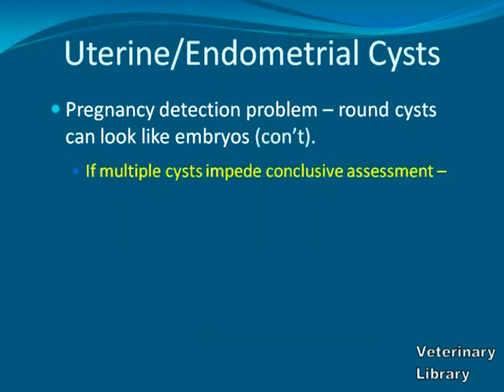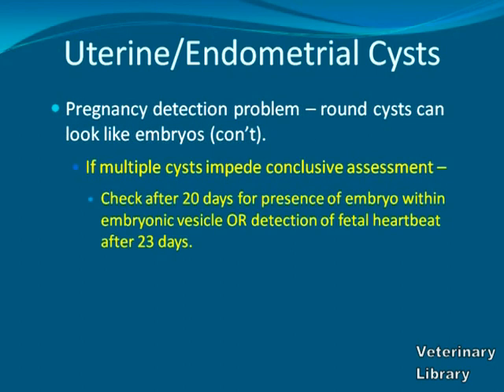If multiple cysts are present and impede a conclusive assessment of pregnancy, then the mare can be examined again after 20 days for the presence of an embryo within the embryonic vesicle, or after 23 days for the detection of a fetal heartbeat.